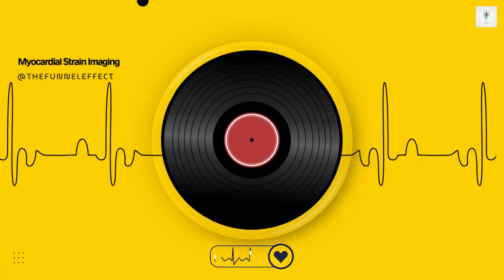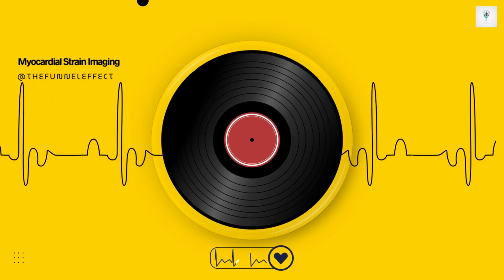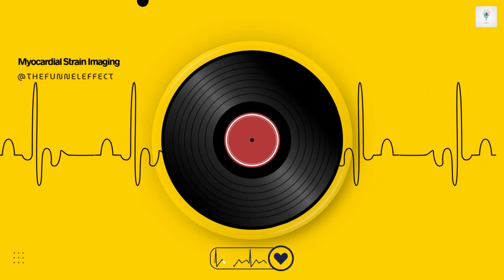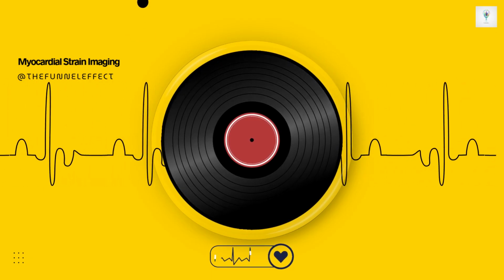Why is this potentially better than just looking at strain? Because it incorporates the effect of afterload directly into the measurement, and it uses the strain values measured throughout the entire systolic phase, not just the single peak value. It gives a much richer, more comprehensive picture of the heart's mechanical efficiency under its actual working conditions.